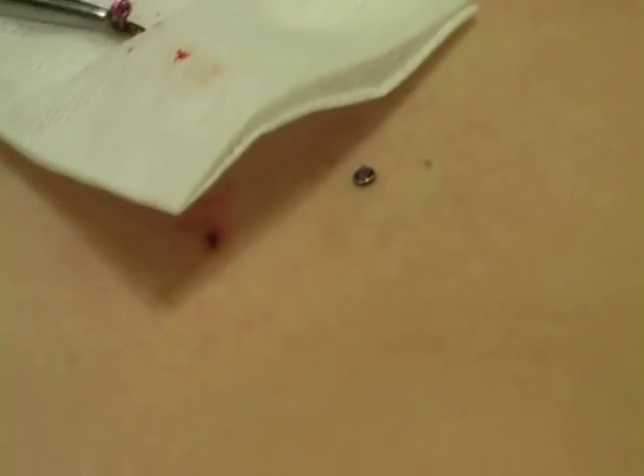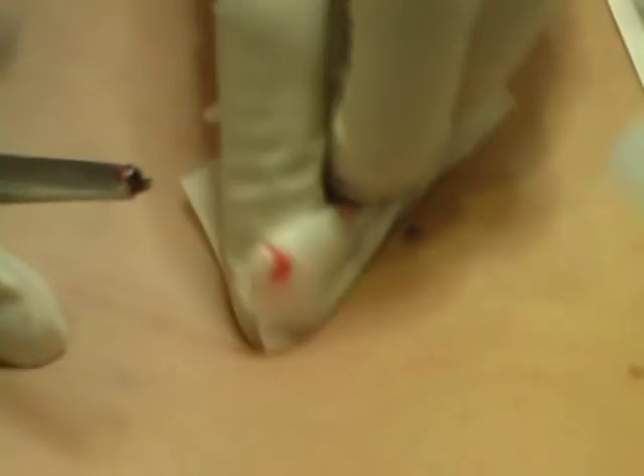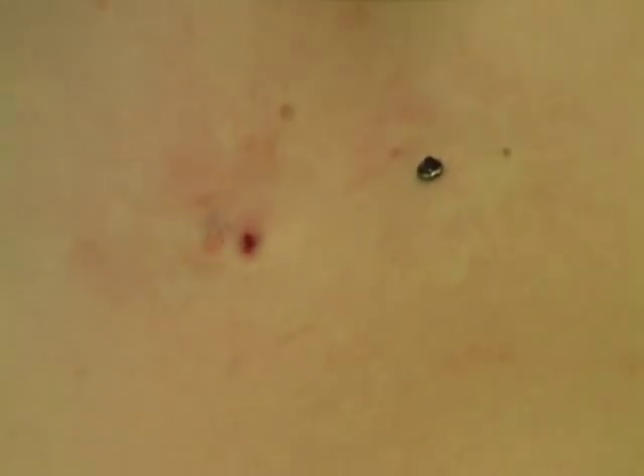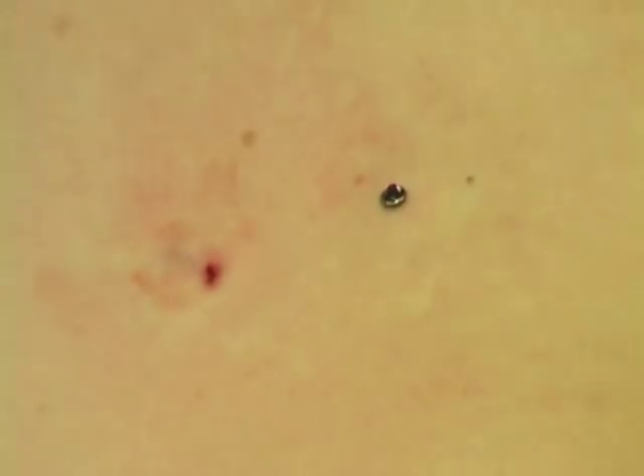So that's what it looks like. Do you want to keep them? What we've done is we've just made it a little bit like a keyhole incision. There was a hole where the piercing itself was and we've just literally made a tiny little cut just to allow us to sort of flip it out. I don't think there's going to be much point in trying to stitch that because all of that is going to be epithelialised inside the cavity. It may be that we just put some sticky strips on there just to hold that together. I don't really want to close a cavity which may actually form a route for infection, because that cavity, strictly speaking, is not sterile.